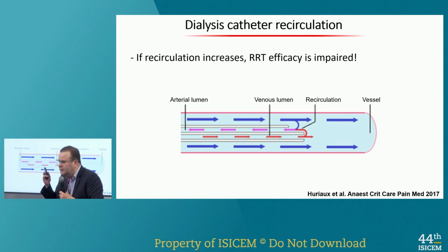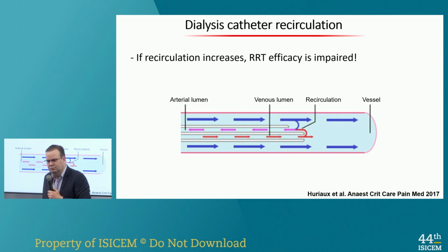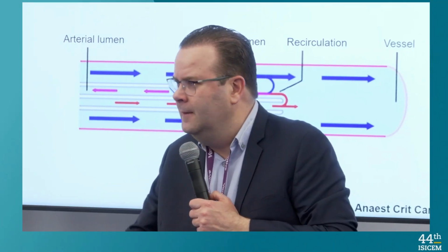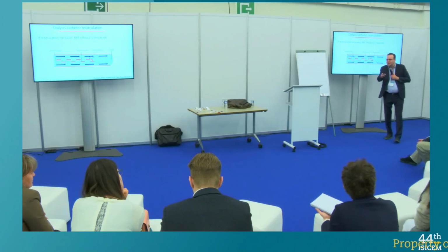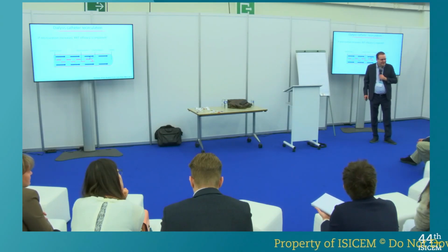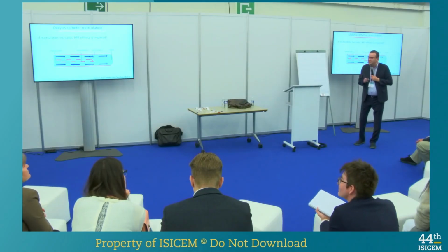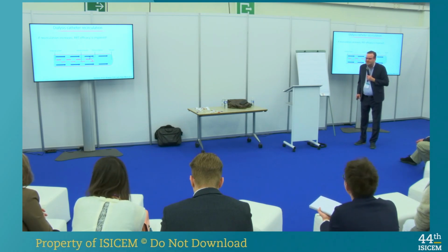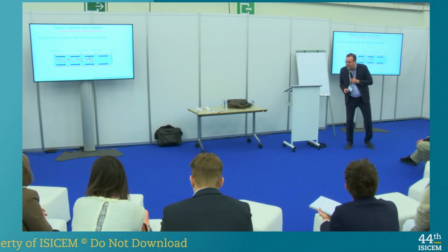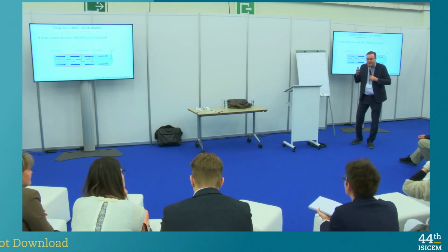In which other condition will there be a lot of recirculation? Do you have any idea? When you do something on your circuit which is not good and you know it, but you still do it. When we switch the lines. Very good, exactly. You know it when you do it, but we still do it. Why? Because it's going to fix some pressure problems.